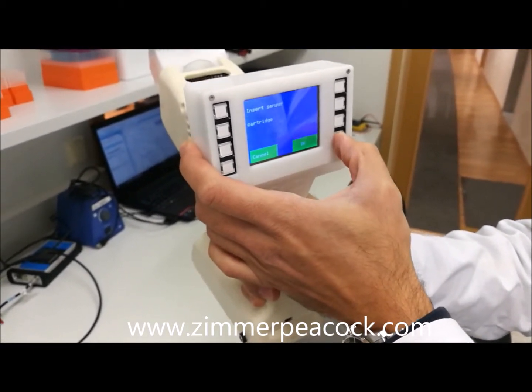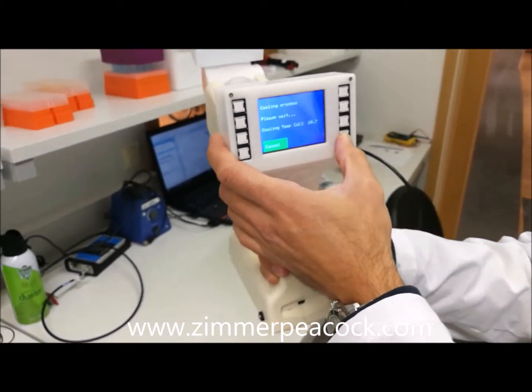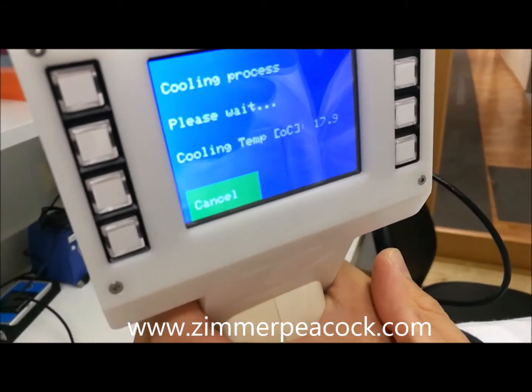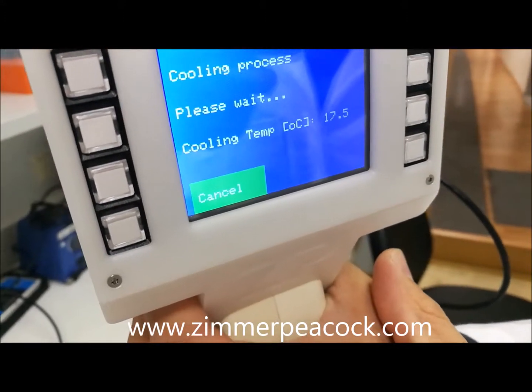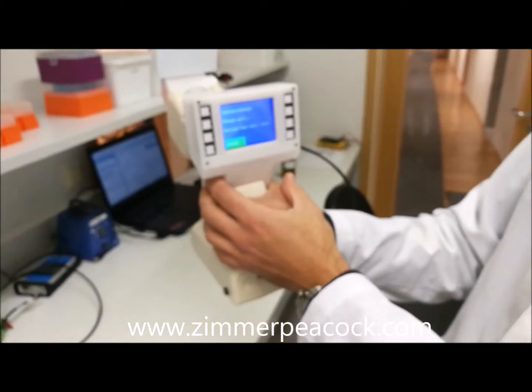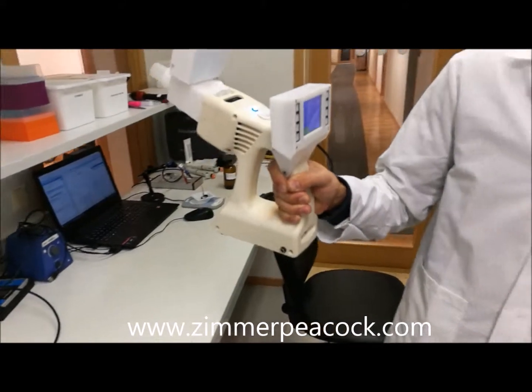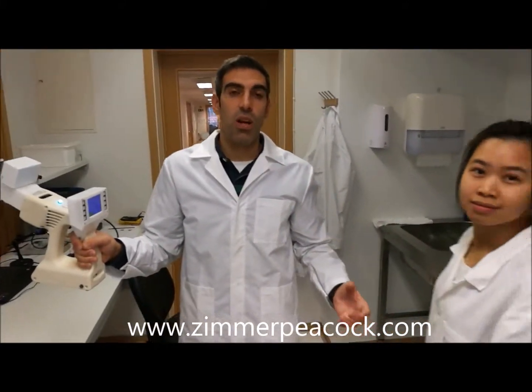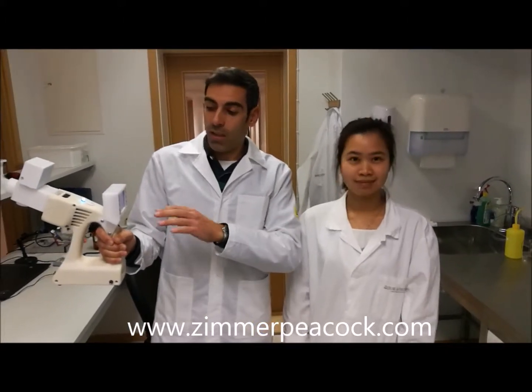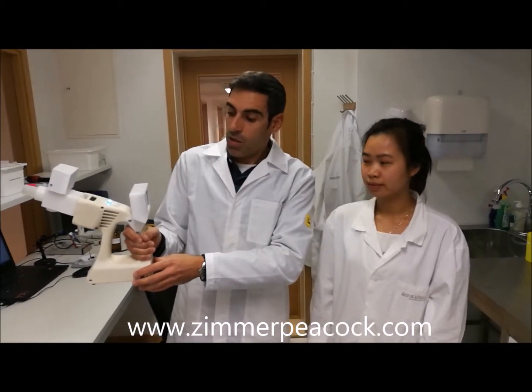We have inserted the sensor cartridge and now we start the cooling process, where we have to wait for it to reach the desired temperature — in this case, 3 degrees Celsius. There will be a little waiting here. In the meantime, I'm going to introduce another scientist here at Zimmern Peacock.